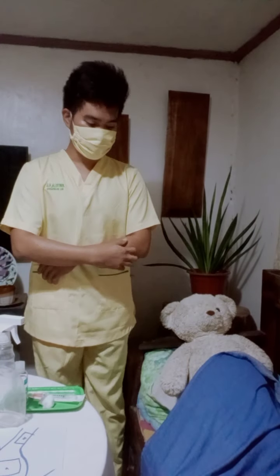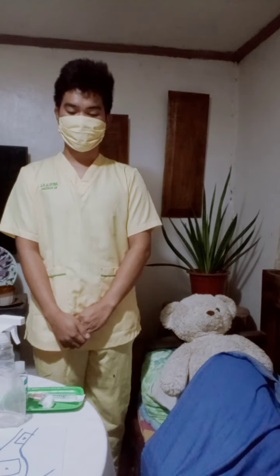So good day ma'am, I am Kirby Huntilla. Today I'm going to perform the self-injection of insulin. First, we have to prepare the equipment.